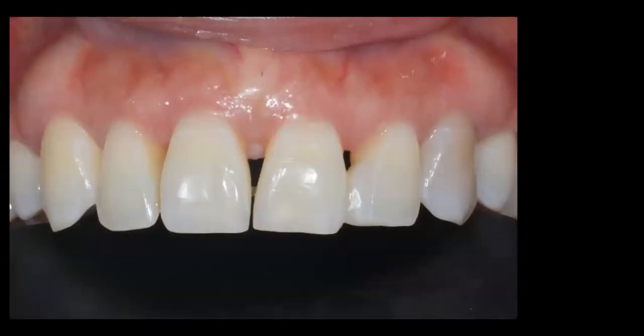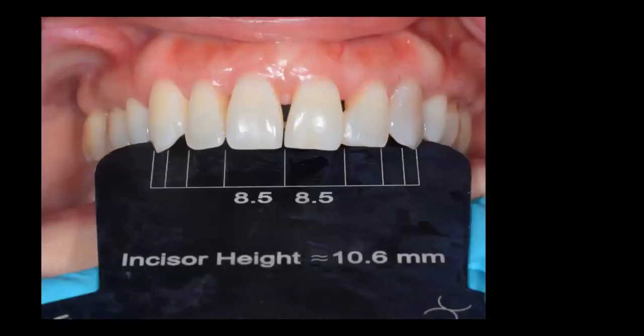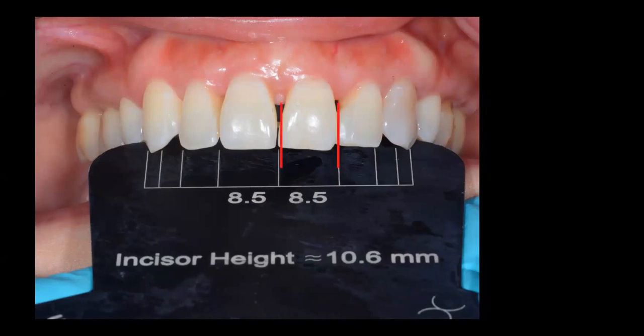And so when I look at this case, we're going to be doing a lot of things. I'm going to be moving the midline over here so I can split the distance between these two teeth. I want to upright the midline. So this is the Smile Design gauge. This is one of the tools that we use for both diagnosis and then to treat the case. So I'm going to move the midline over. That will allow me to mitigate the space here. So I'll do both the centrals and the laterals.